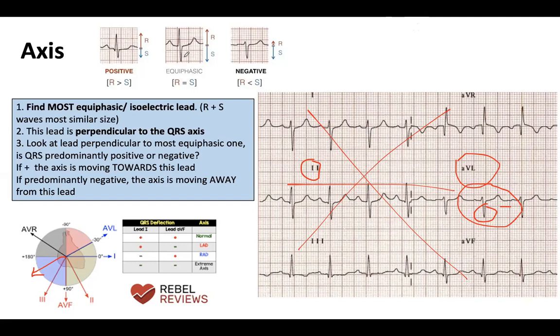Okay, so someone has asked if lead 2 was negative. What do you mean if lead 2 is negative? If lead 2 was negative, then you'd look for, oh, sorry, that was the previous one. Okay, sorry. You can save those types of questions, take a screenshot and keep them for the end, then we can go through them. Okay, so I'm glad all of you understand this so far.